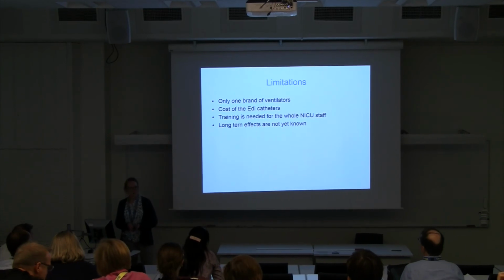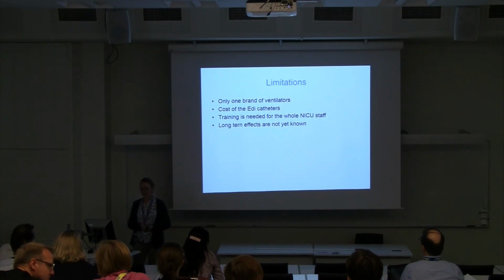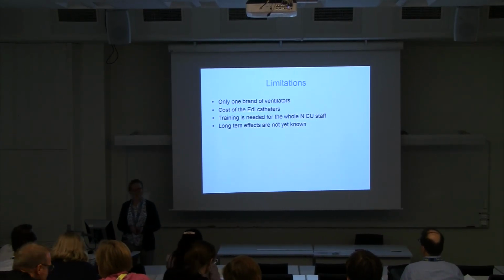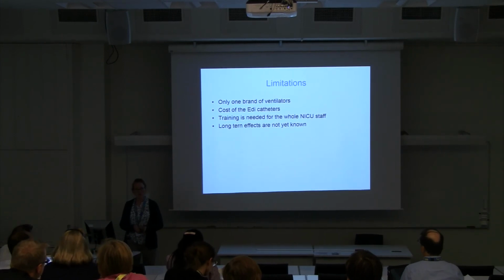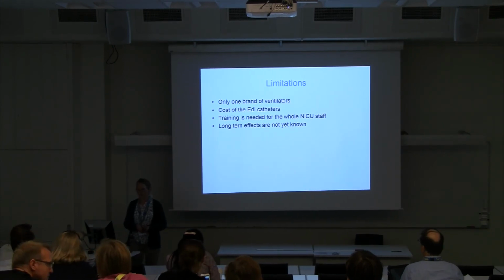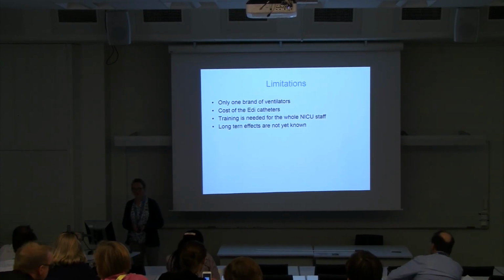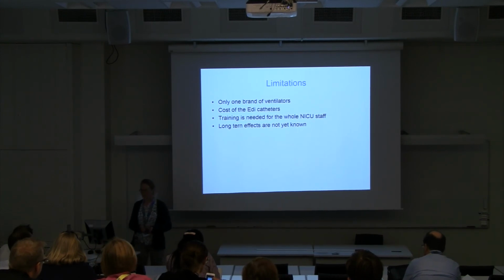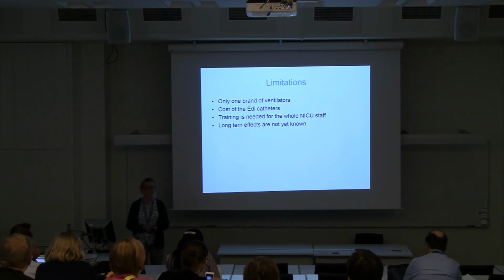There are also some limitations that I need to mention. The NAVA ventilation is limited to only one brand of ventilators. And there is an extra cost for the EDI catheters. And also a lot of training is needed to train the whole NICU staff for this new type of ventilation. And long-term effects are not yet known.